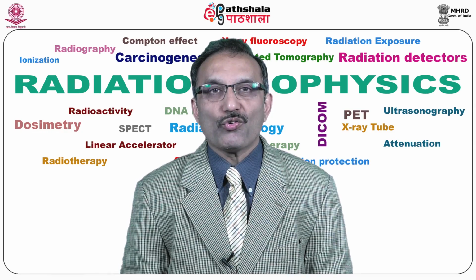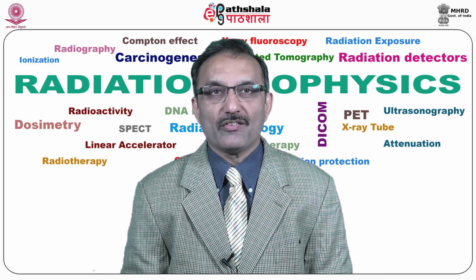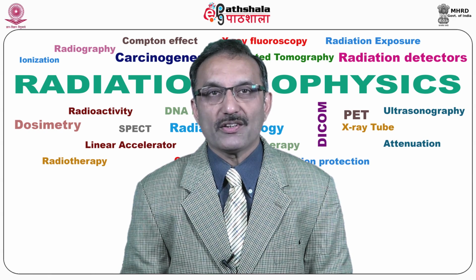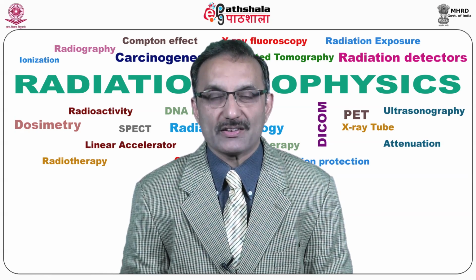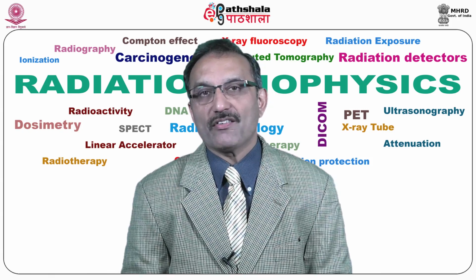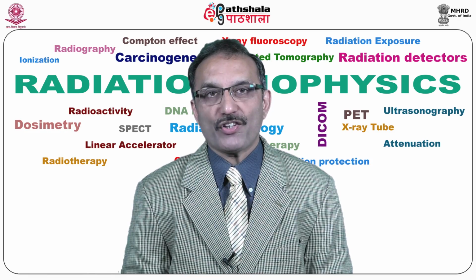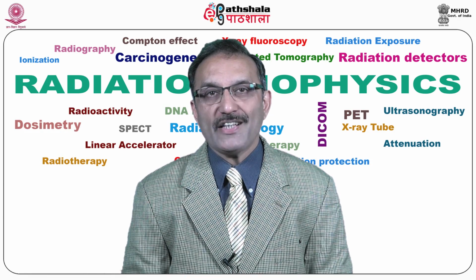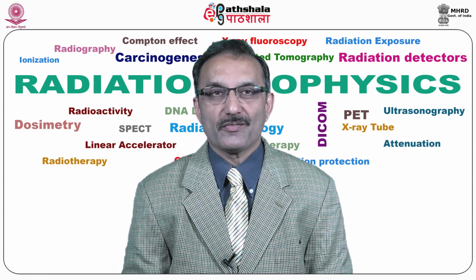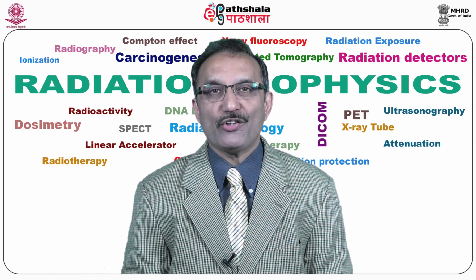But if you would like to know how the organs are functioning, this is the only technique available which utilizes radiopharmaceuticals to image and gives the functioning of those particular organs. A radiopharmaceutical is generally made of 2 parts, which we'll see in the further slides. First is a pharmaceutical that targets a specific organ or tissue, and a radioactive material, called a radionuclide, that gives us small amounts of radiation. It means a radiopharmaceutical is a combination of a pharmaceutical and a radionuclide.